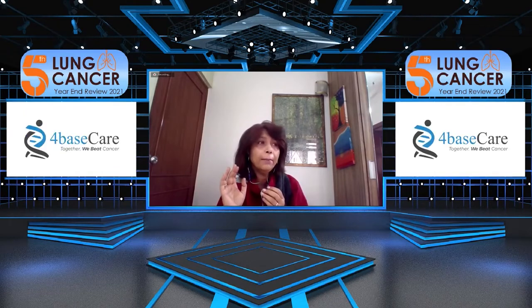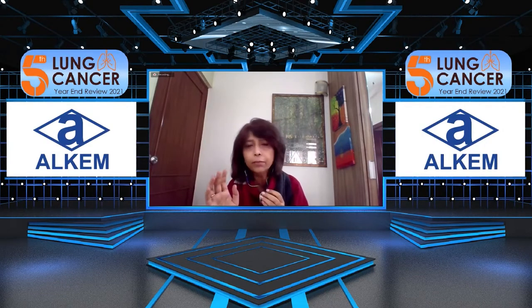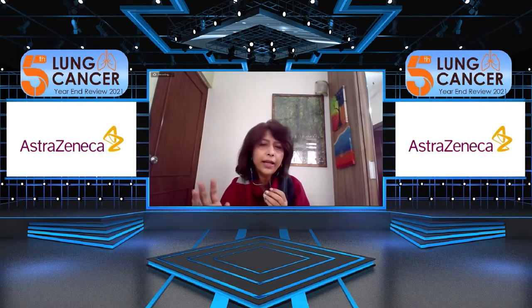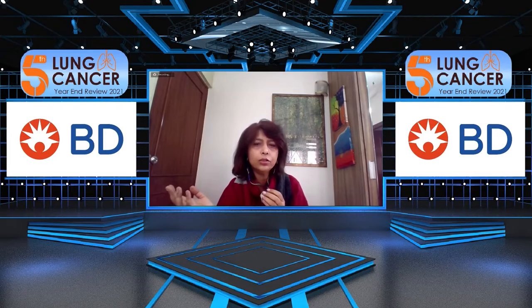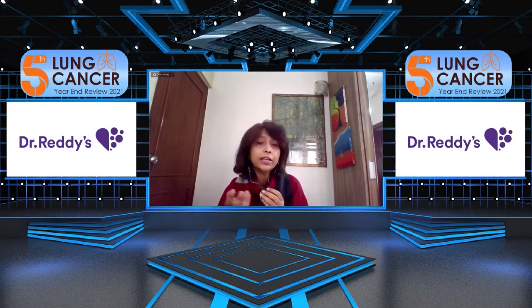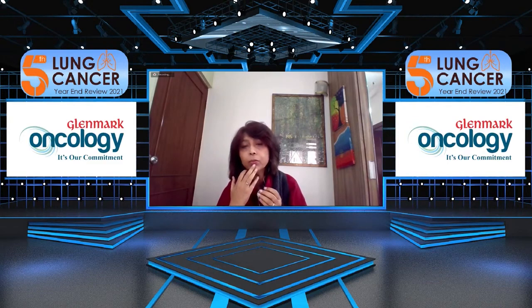So, but another thing in incidentally detected, I'd like to reinforce is that ask patient for any previous study. It sounds like a very commonsensical thing. But from the time that patient was born, if he has done any CT, if the nodule has been there for a while, it solves your problem. Otherwise, biopsy, negative biopsy or nodule for whatever reason not amenable to biopsy, it's better to go for an upfront resection, because at that point patient may need a sublobar resection or lobectomy, and subsequently, adenocarcinoma may grow. Most of these PS nodules and these things are adenocarcinomas.